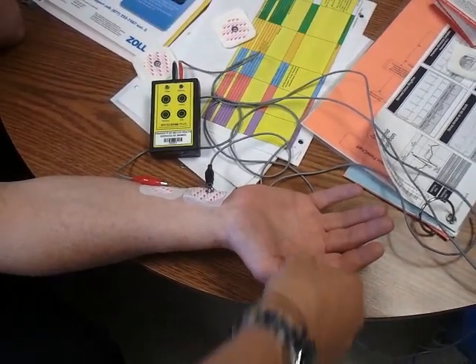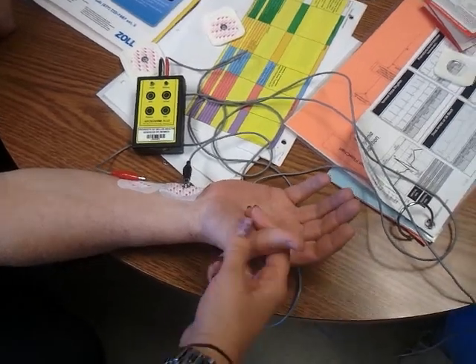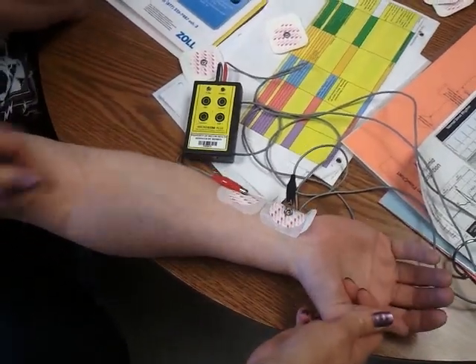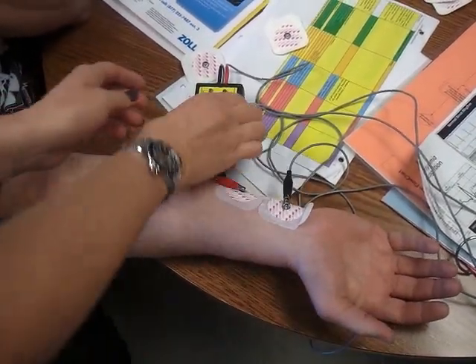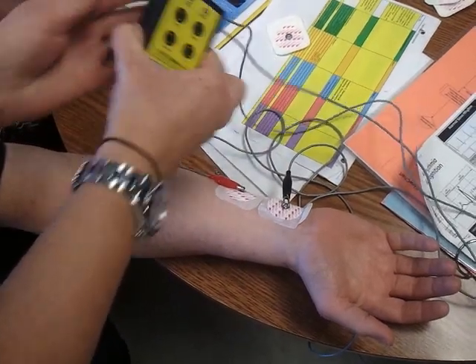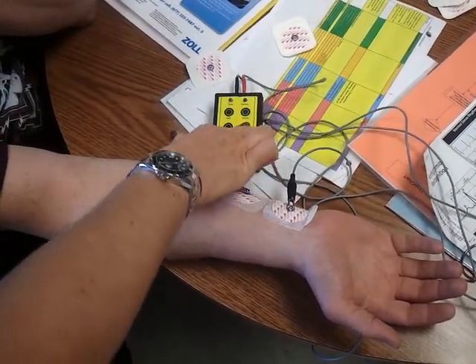We should see the thumb twitch. So you may want to put your fingers in here so that you can feel it and see it. Alright, so we'll turn it up to two. Hit the button again.